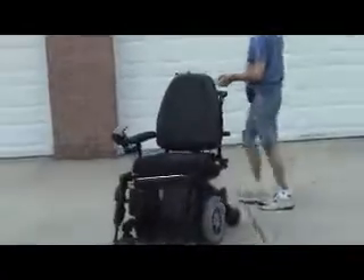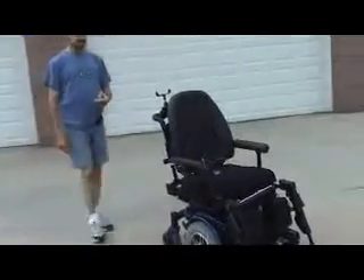Straight. Straight. Right. And there we have it. Thank you.